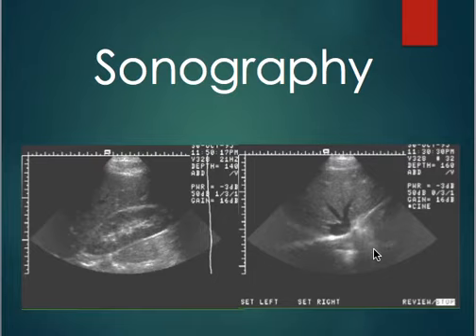So ultrasound imaging can also be called ultrasound scanning or sonography. The terms are kind of used interchangeably. So with ultrasound, it's a relatively inexpensive, fast, and radiation-free imaging modality. Ultrasound is actually very good for non-invasively imaging and diagnosing a number of organs and conditions without, again, using X-ray radiation.